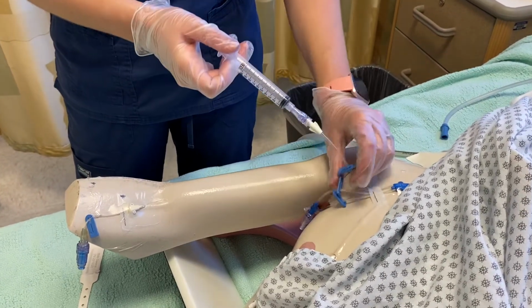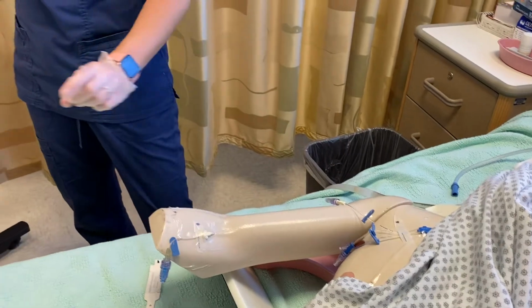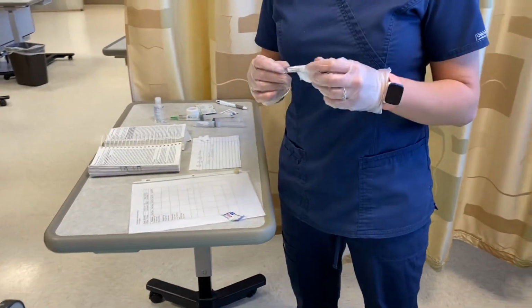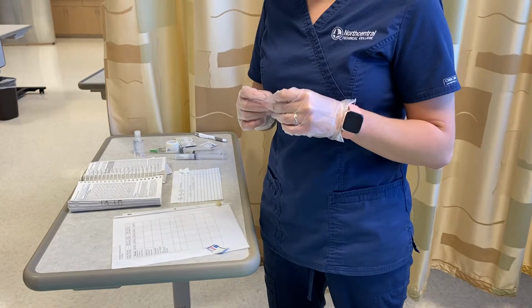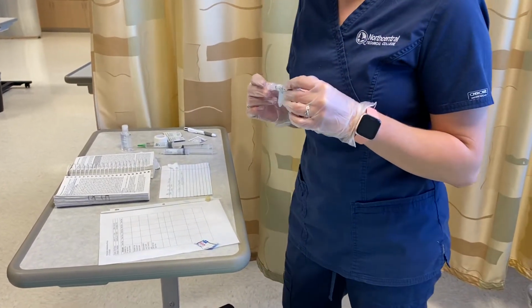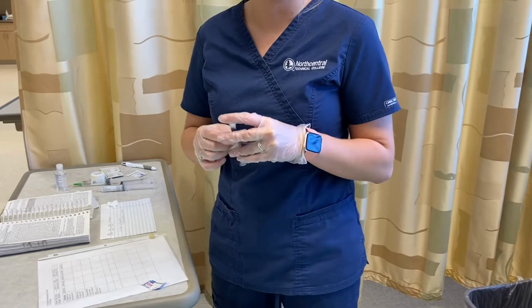Okay, we're going to clamp that. Remove. Okay, I am going to then check my rights again. So I have hydromorphone for Bob Owens, 1 milligram IV push every 3 hours, PRN for pain. He has not had it in the last 3 hours, and we are going to be giving a total dose of 0.5 mLs to get that 1 milligram.